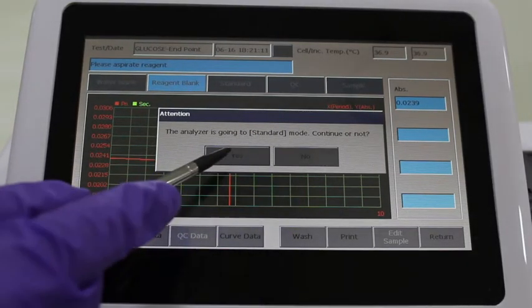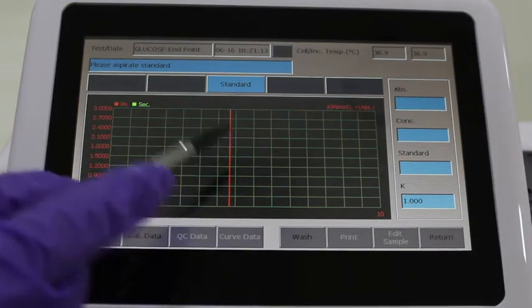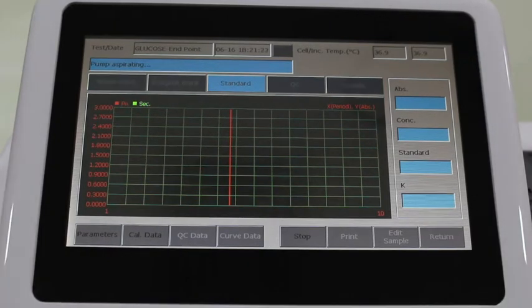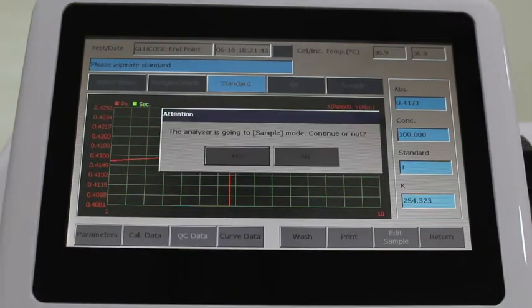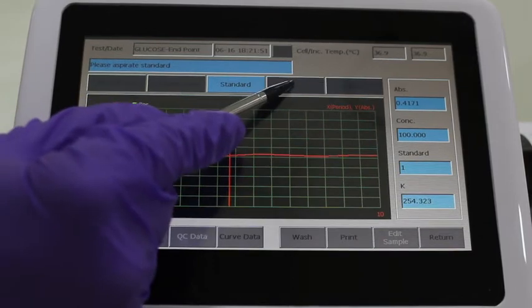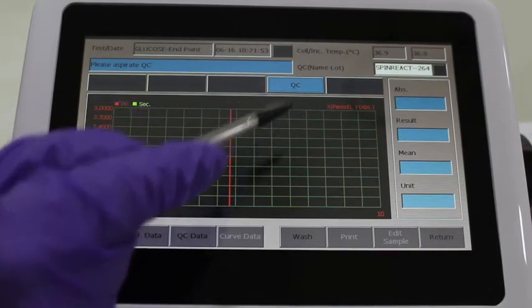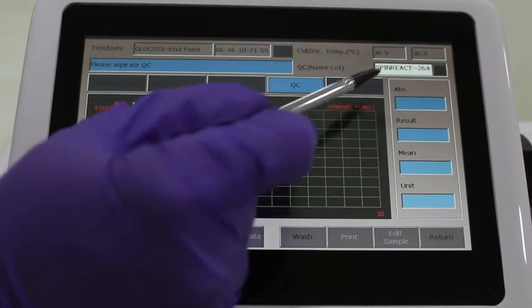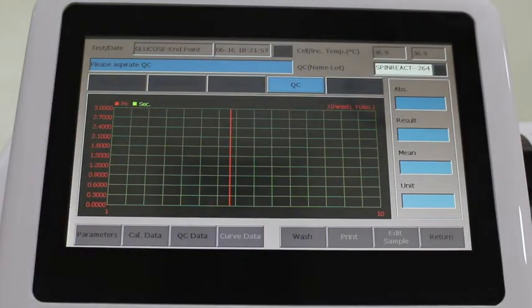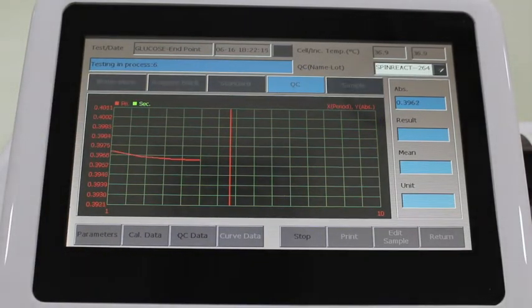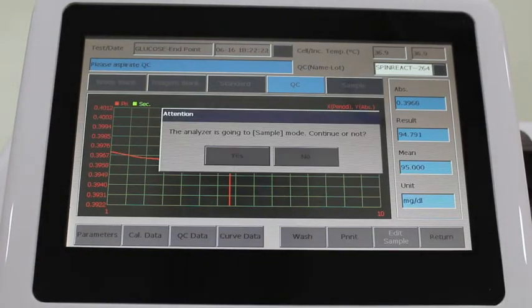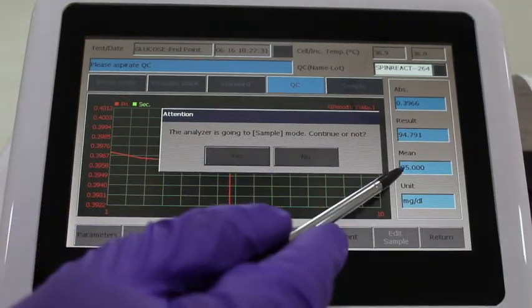Okay the same and aspirate reagent blank. The process repeats and reagent OD is displayed. Now the instrument is ready to run the standard. Once given okay, it will ask to aspirate standard and the standard is run and OD is displayed. QC can be run if required to confirm the performance. QC has to be selected and then aspirated. Values and lot already stored in QC menu. Once QC is okay, you can check the values and then run the samples.